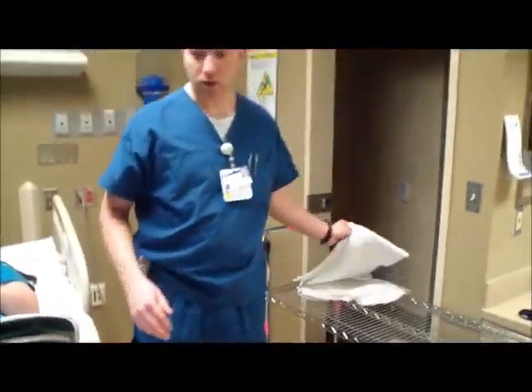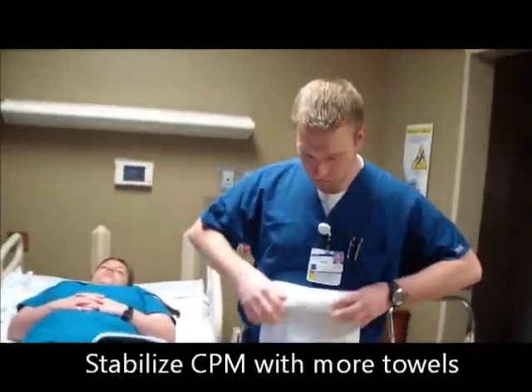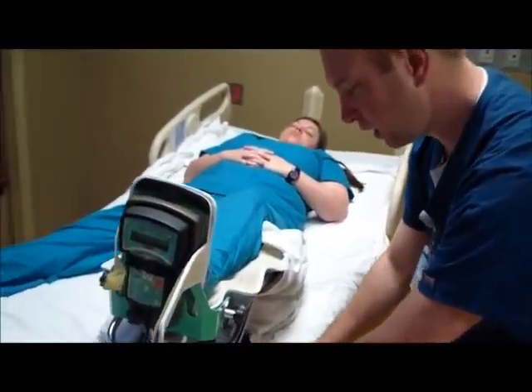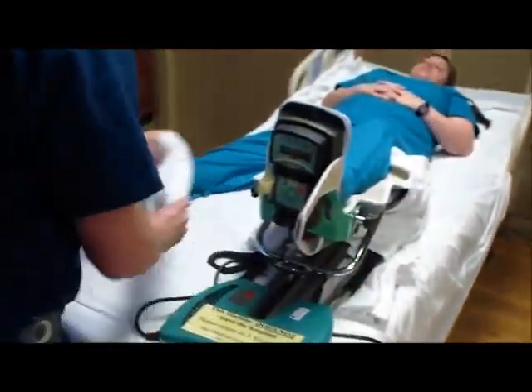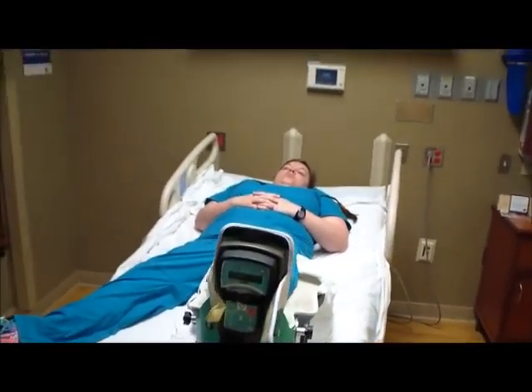What I'm going to do as well is make sure our device is stable laterally. So I'm just going to fold some towels and place them, you've got some bars here on the outside and the inside, to help stabilize this device a little bit more.